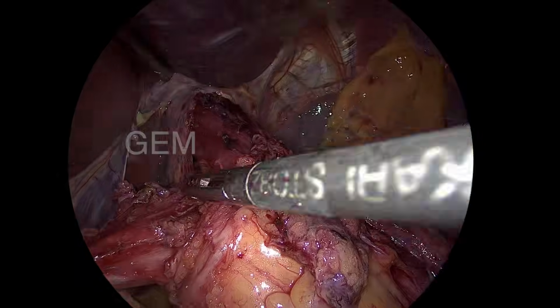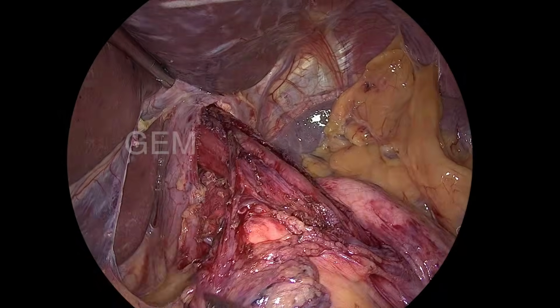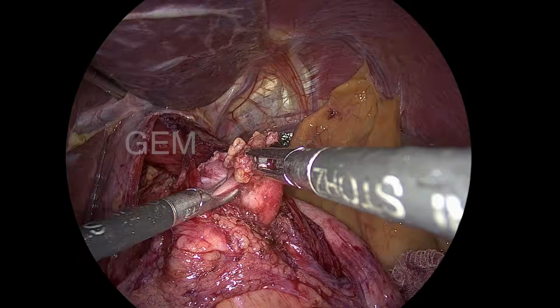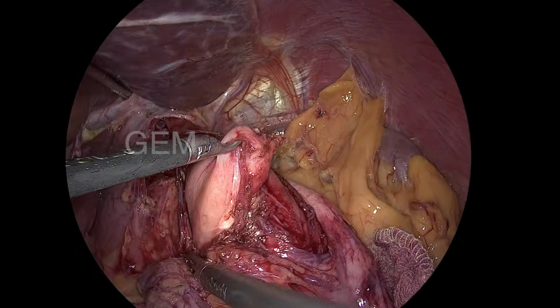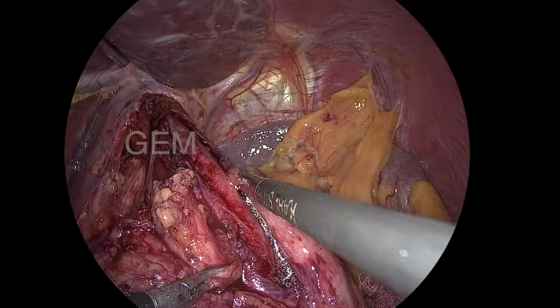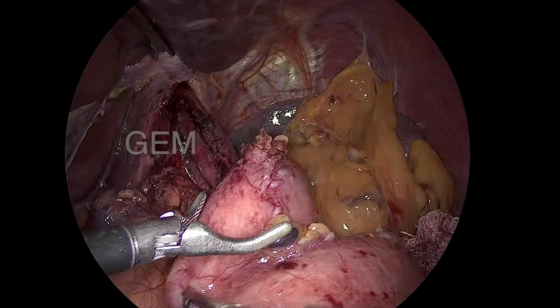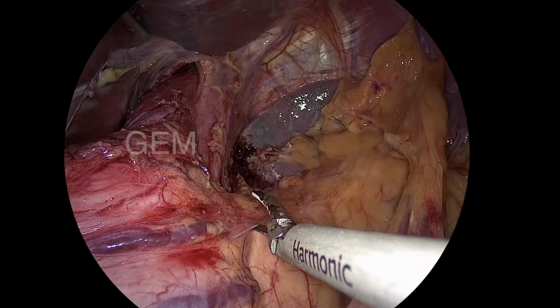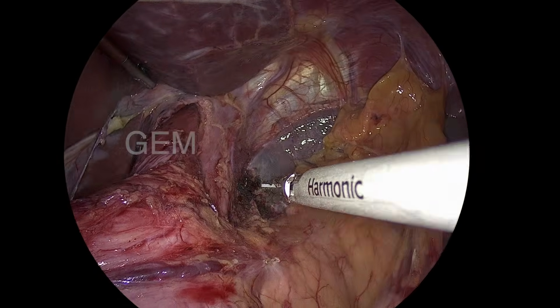But in a regular case, even if you do endoscopy, you are only doing the air. So, here it is very easy with the Ryle's tube, and arranging endoscopy during laparoscopy is a little time-consuming and cumbersome. So, this is the easier way. This is a very relaxed fundus, no tension. A little bit of tension is there, so I am just checking that area. I am releasing it again from the pancreas.